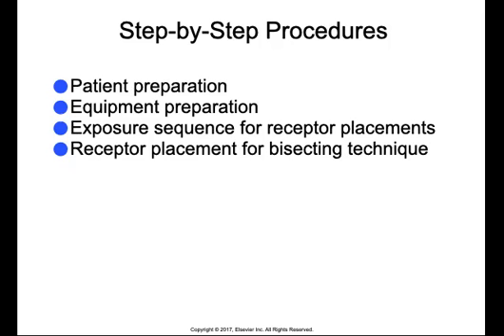So for patient preparation, after completion of all infection control procedures and preparation of the treatment area and supplies, the patient should be seated. After seating the patient, you must prepare the patient before the exposure of any receptors.